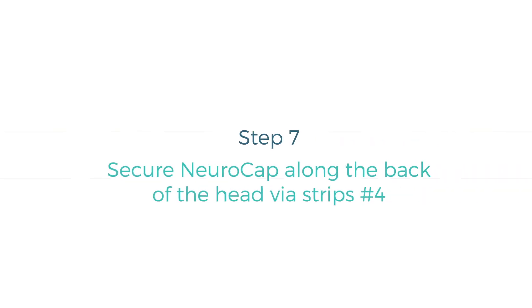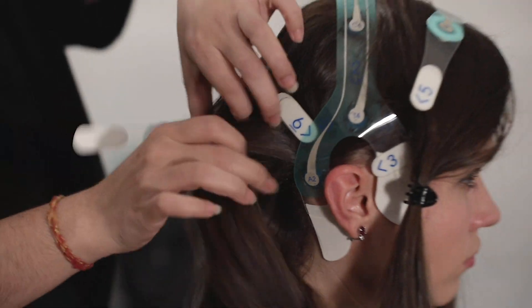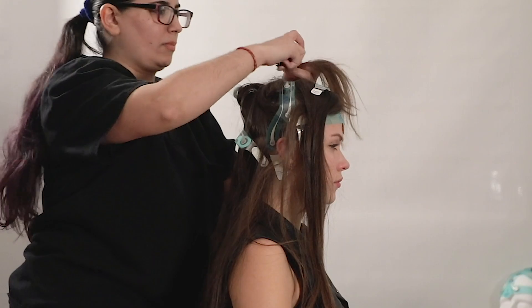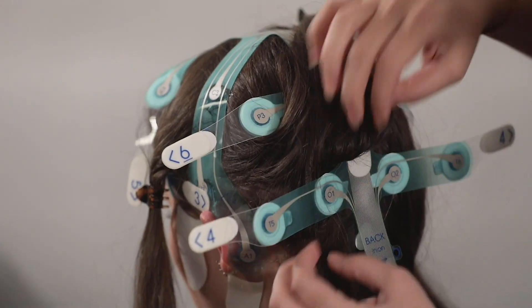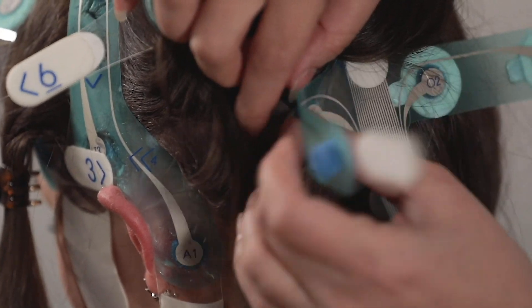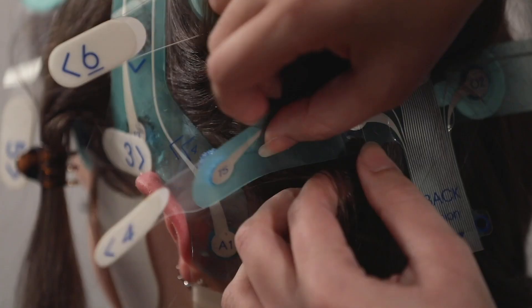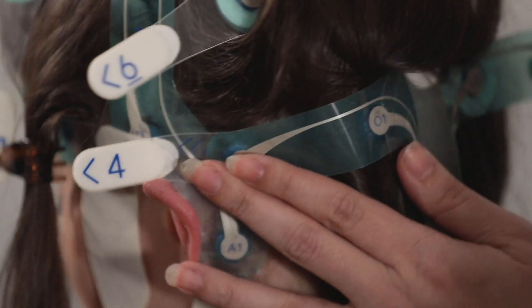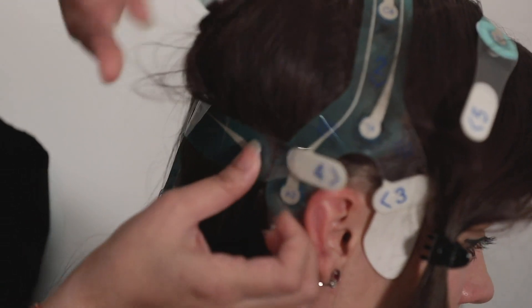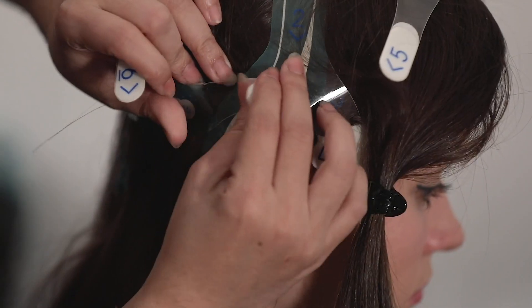Secure NeuroCap along the back of the head via strips — this step is similar to the previous one but performed on the back of the head. Apply the back strip marked number four around the back of the head, making sure each sponge electrode is placed flush along the open scalp area. The area will be marked number four with two arrows above the earpiece. Repeat for both right and left sides of the head.